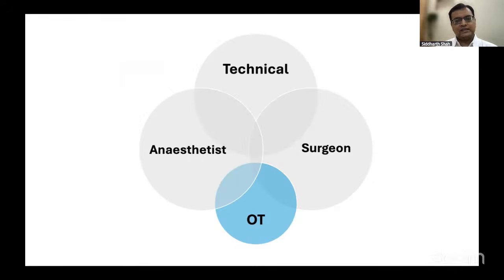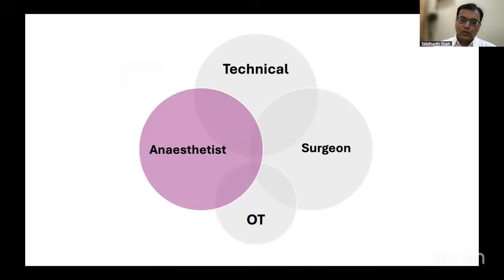So the first thing is, I would ask my circulating staff to stop the music. Have the anesthetist inform the lead anesthetist, if they are outside the OT, to come back in. It's always good to have 2 anesthetic team there. Have the neuromonitoring team be on alert. Have the staff get ready warm saline in the corner. So there are small things which are going to be ready for us to action as we go through the steps, and each of them relies on you identifying it and communicating it. First, we'll come to the anesthetic aspect.